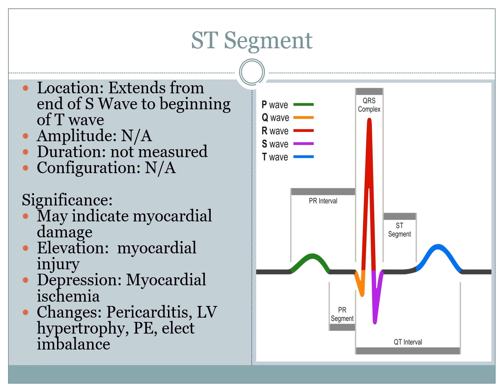Because it's during this phase that all the sodium is in, potassium's out, calcium's finished moving, stabilizing, and everything's just about to reverse itself. If you have an imbalance of those electrolytes, then you can start to see changes of this ST segments and then further changes of the T wave that we'll discuss.